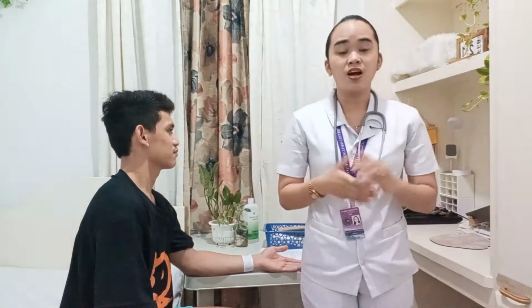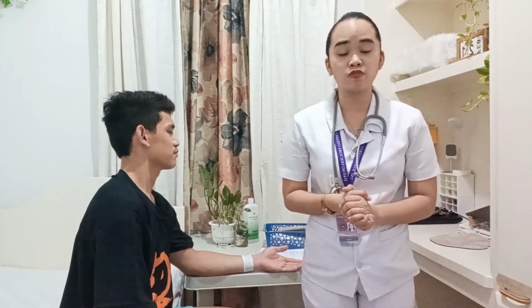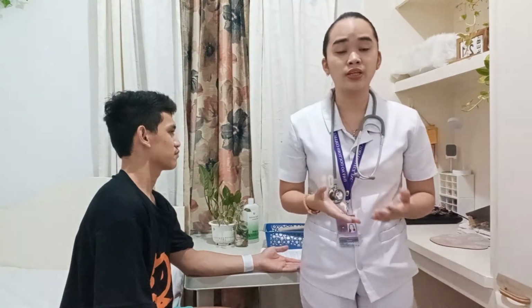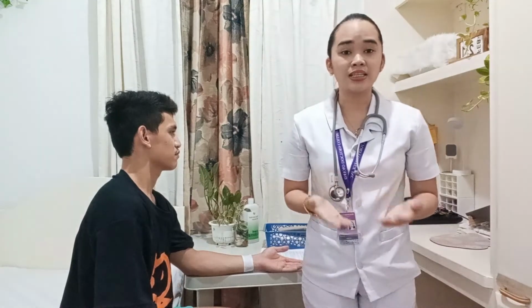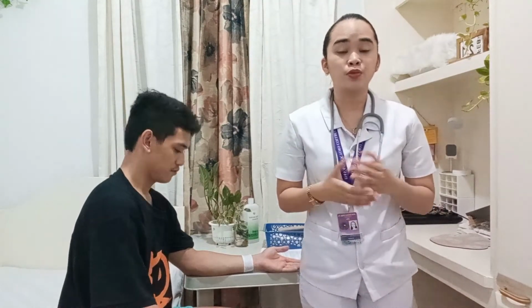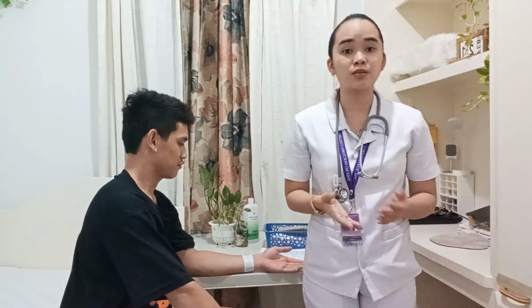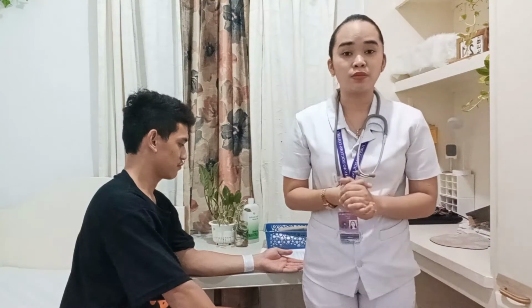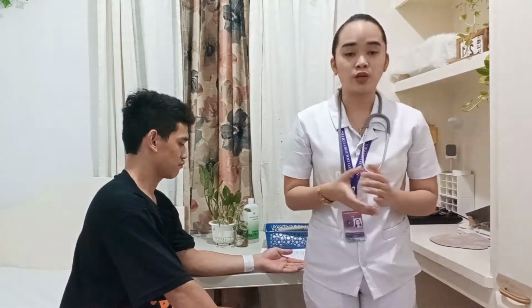Okay. Also, since this is the initial examination of my patient, I will perform the preliminary palpatory determination of his systolic pressure. The initial estimate will give us the maximal pressure that the sphygmomanometer will be elevated to in a subsequent determination. This will help us avoid underestimation of the systolic pressure and overestimation of the diastolic pressure.